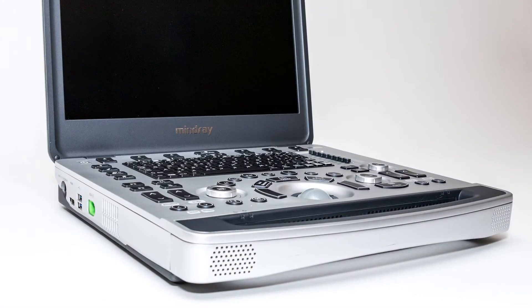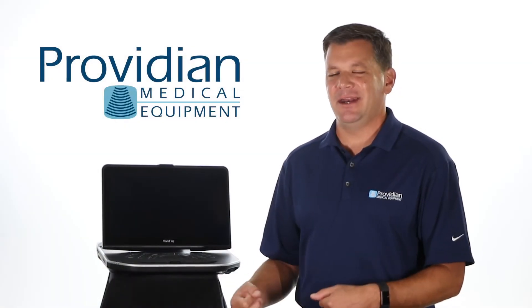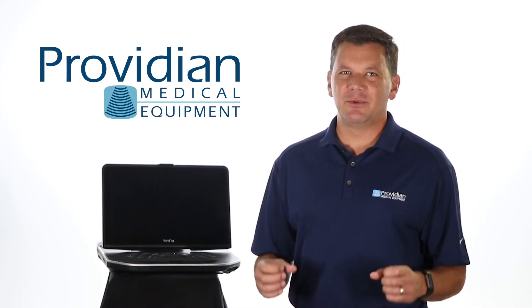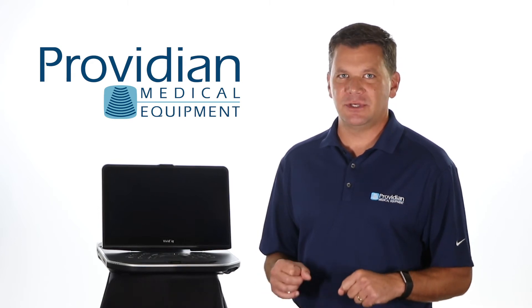The Mindray M9 is more of a whole body system that does do a great job, but it's rare to find someone who chooses the M9 over the Vivid IQ for cardiac imaging. Additionally, the Vivid IQ has the most advanced feature set and workflow of any portable cardiovascular machine out there.